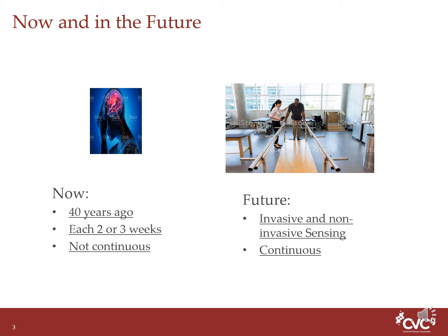Let's take an overview of the actual rehabilitation state. Any middle-aged woman or man is highly exposed to the risk of getting hit by stroke. If you survive the stroke, you will undergo a rehabilitation process in order to recover a part or most of your functional abilities, depending on your situation. The present issue is that if the rehabilitation process is not optimal and accurate enough, the patient may lose a part of his functional abilities forever. That's why it is important to have a continuous evaluation of the patient's physical condition.